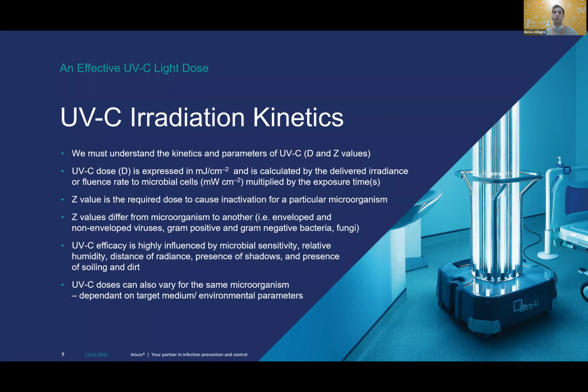These all contribute to different Z values and to different doses. What we want to say here is that all these parameters have to be taken into consideration in order to be able to back up any data that's supporting a specific Z value against a specific organism.